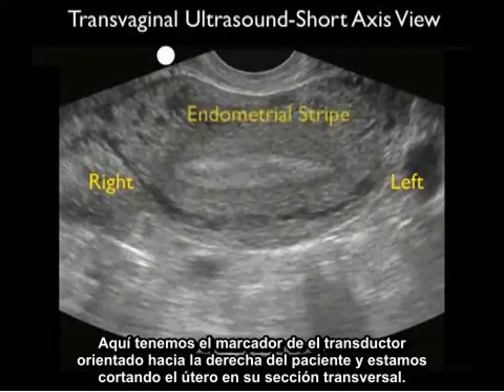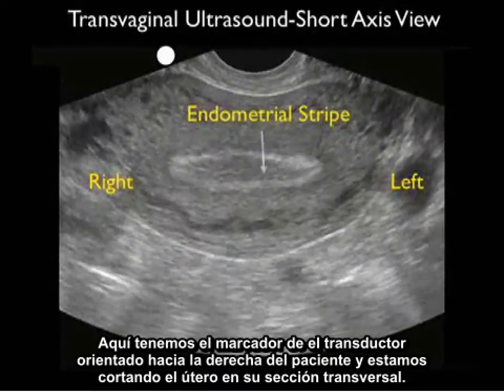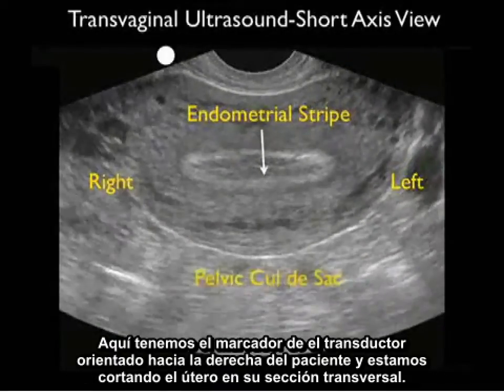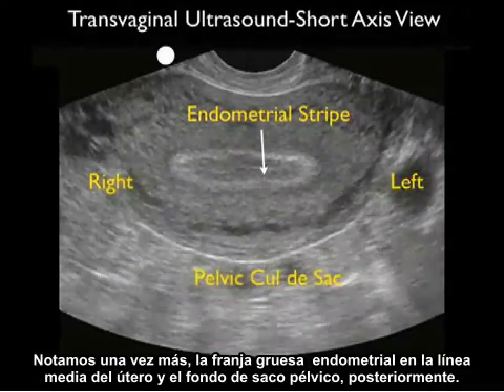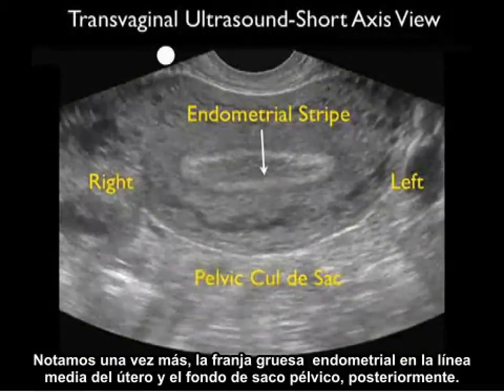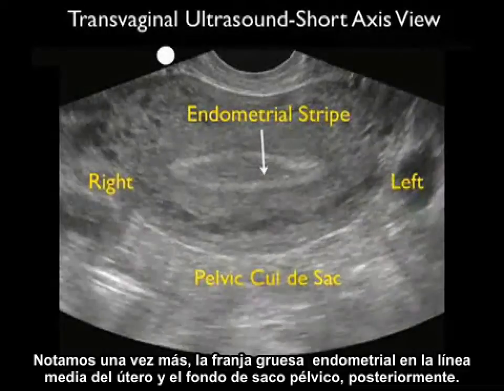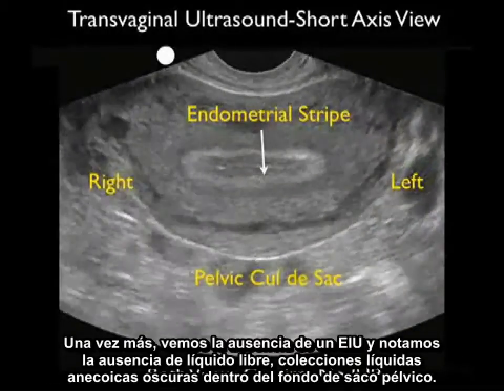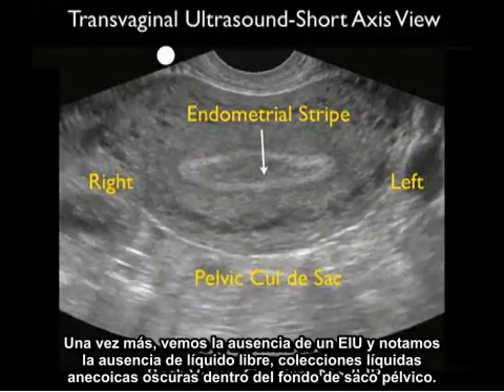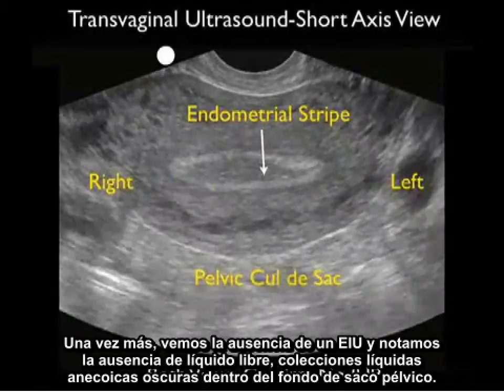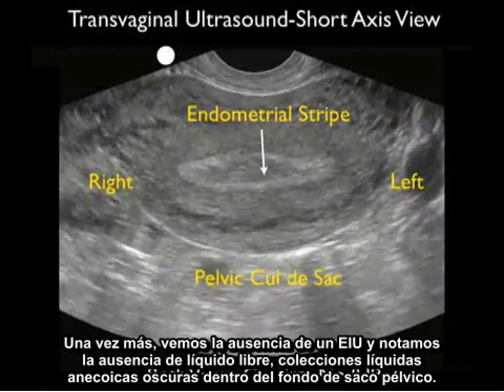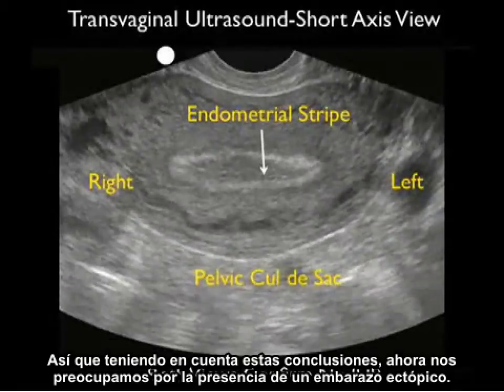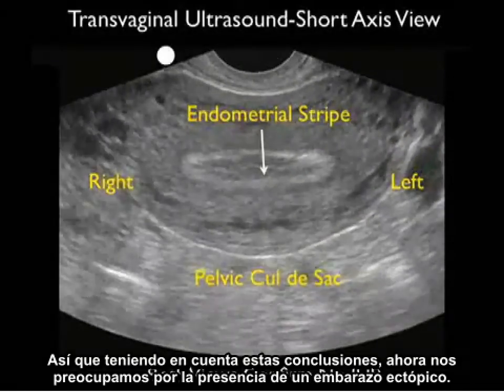Here we have the probe marker oriented towards the patient's right and we're cutting the uterus in cross section. Notice again the thickened endometrial stripe in the midline of the uterus and the pelvic cul-de-sac posteriorly. Again we see the absence of an IUP, and also note the absence of free fluid — dark anechoic fluid collections within the pelvic cul-de-sac. Given these findings, we're now concerned about the presence of an ectopic pregnancy.